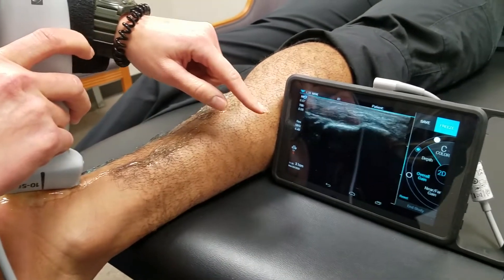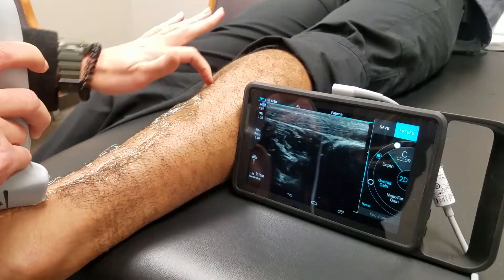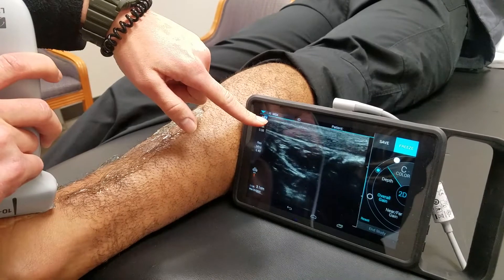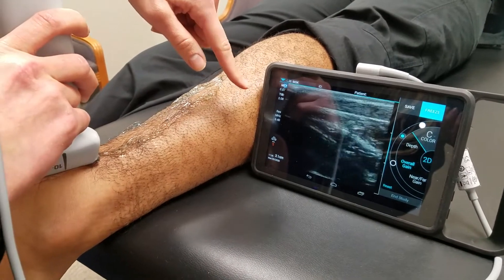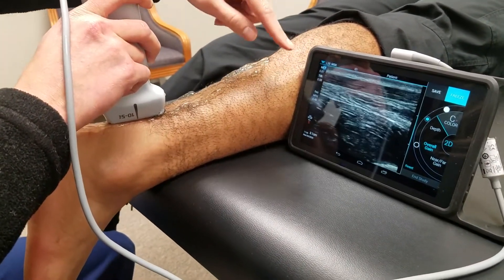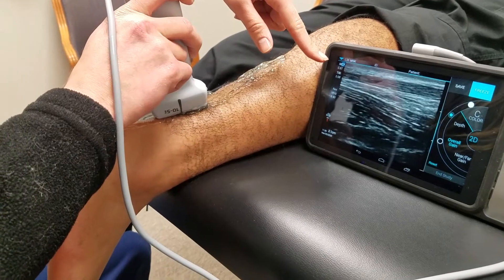As we scroll upwards, you can see right in this area where there's a little fat pad. Then here's your Achilles tendon all the way up, and we're just going to follow it up all the way. There's some more fat pads — that just helps give the tendon a little less friction as it moves around on the bones. And then we're starting to get some muscle down in here; it's still mostly the Achilles tendon, and we're still moving up.